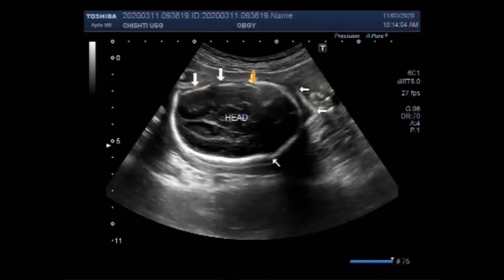If the overlapping is missing, the Spalding sign is negative. You can see the fetus and fetal head.